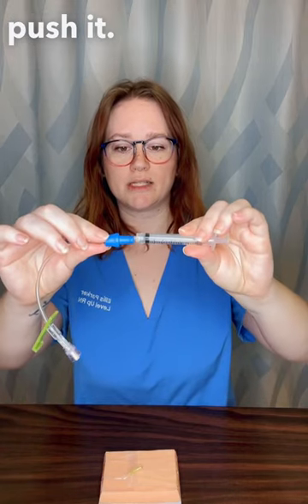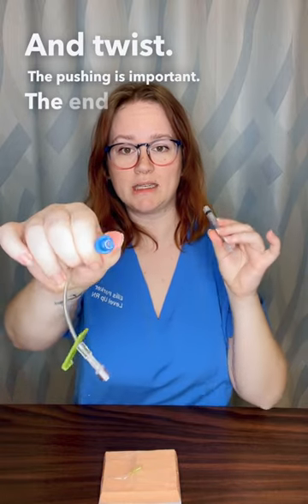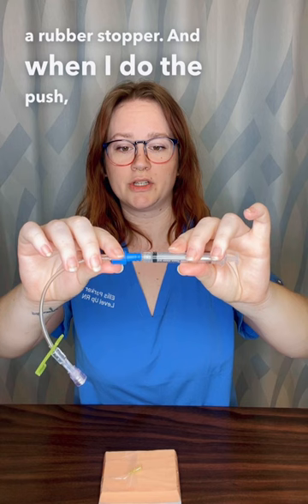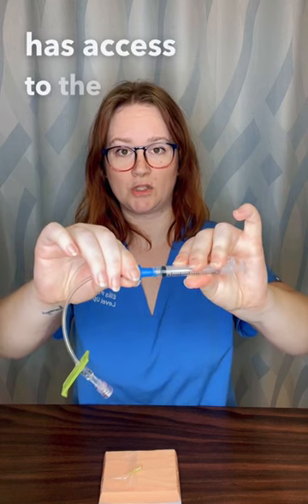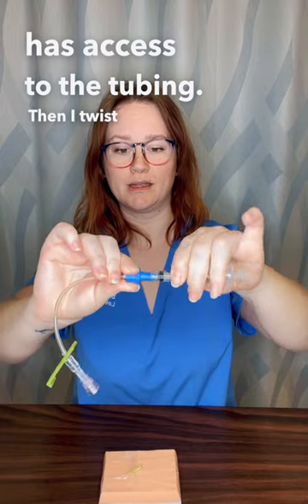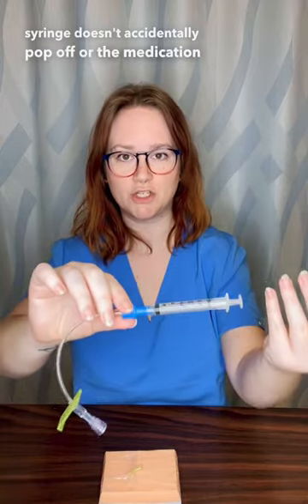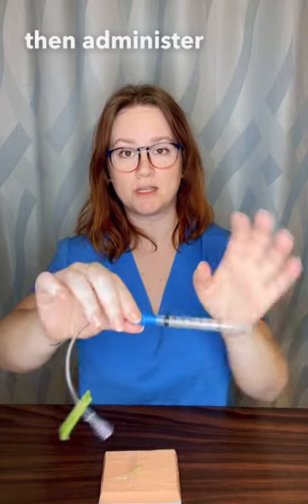I will then push and twist, and the pushing is important. The end of this is a rubber stopper, and when I do the push, I'm disengaging that stopper so that the medication in the syringe has access to the tubing. Then I twist so that the syringe doesn't accidentally pop off or the medication doesn't leak out. This is on there pretty firmly, and then I would administer medication.